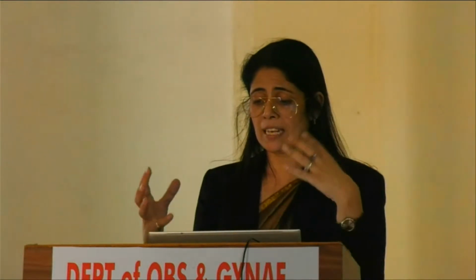I've already showed the amniotic band syndrome, so this was the same case. I'll just show a few cases just to see that, in the 11 to 14 week scan, we can have a constellation of findings which help us arrive at a syndrome or a diagnosis. Meckel-Gruber syndrome is lethal and autosomal recessive.